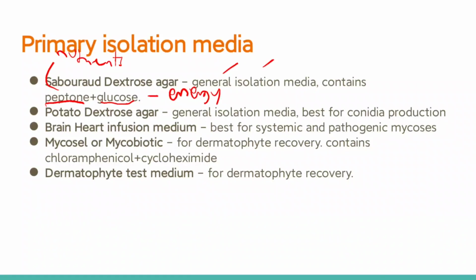Okay? Next, we have also the potato dextrose agar. General isolation media din yan, but this is best for conidia production ng mga fungi. Okay? Next, we have the brain-heart infusion medium. This is best for your systemic and pathogenic mycosis. So, for those that are much serious na or invasive na mga fungal infections. Okay? Next, we have the Mycosel or Mycobiotic.